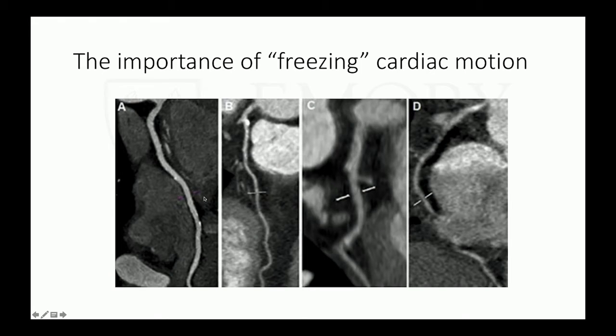So back to the concept of the importance of freezing cardiac motion. I think this is a nice picture that conveys that, where you can really run into a lot of problems if you don't have that. And a study can essentially become non-interpretable.